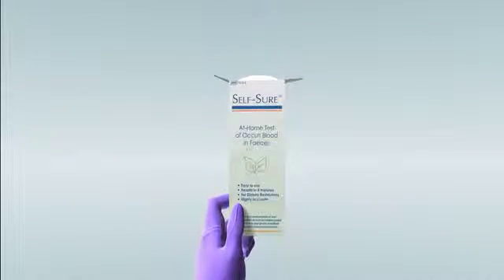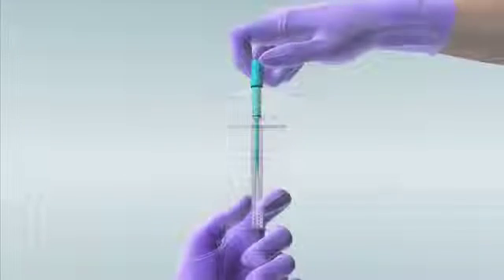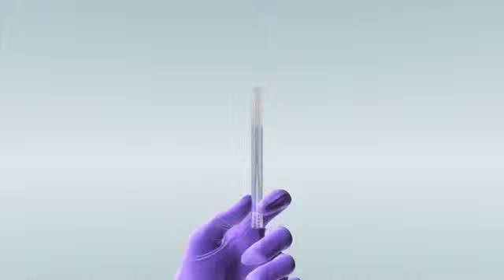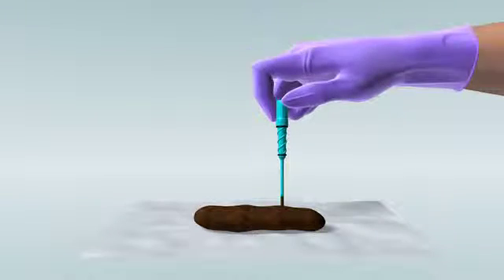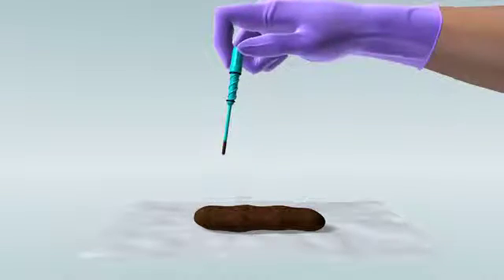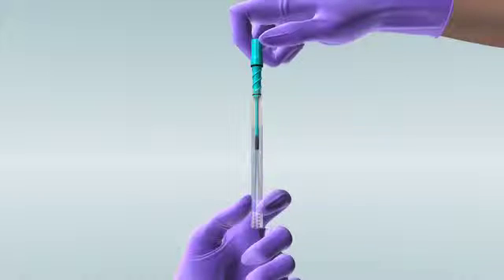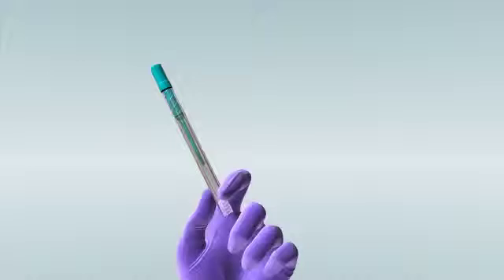To run the test, remove the sampling tube from the box. Remove the sampling wand and dip it into three different areas of your stool. Only a smear is needed — no more than a grain of rice. Return the wand to the sampling tube and screw in tightly. Disperse the sample evenly through the solution by shaking and inverting.